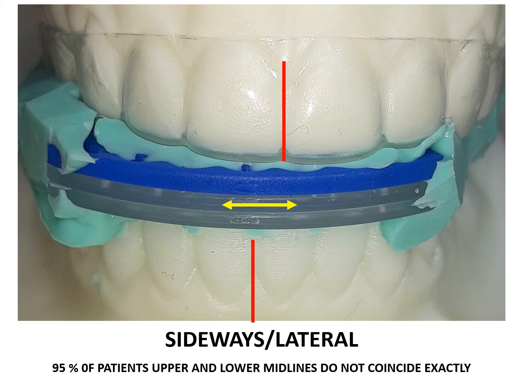It is most important in establishing the sideways dimension that the muscle activity be bilaterally balanced when the patient's in the appliance. Arbitrarily aligning the midline between 8 and 9 over the lower midline between 24 and 25 does not reflect natural human asymmetry or balanced muscle activity.